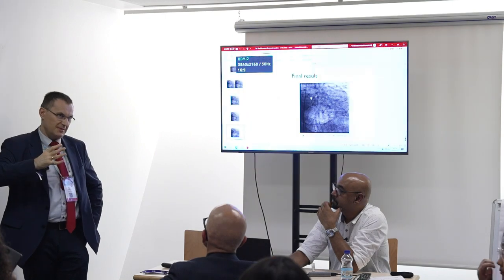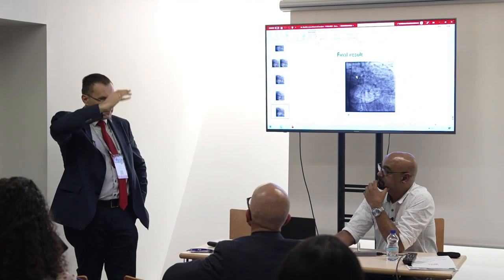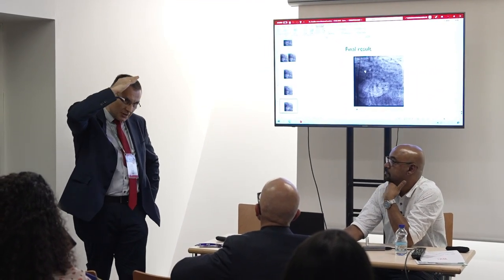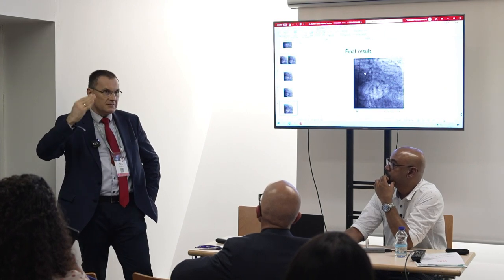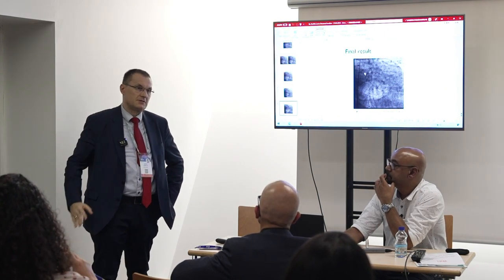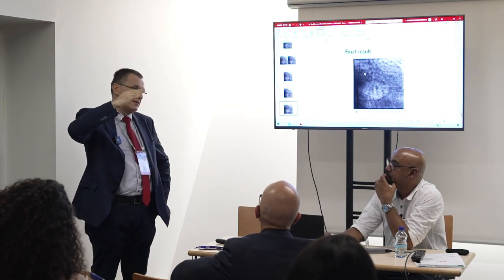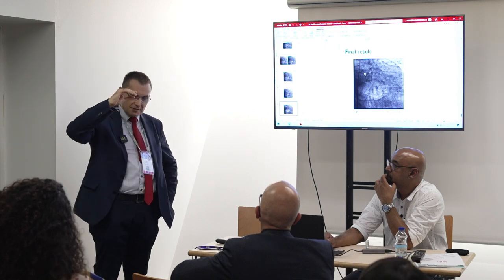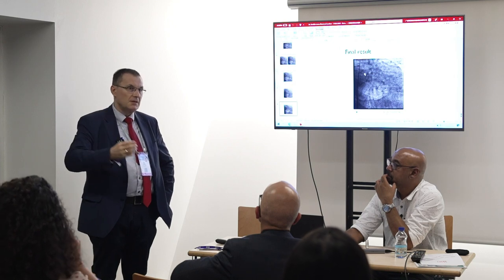As I told you, I placed an extra support wire intentionally. It is not usually recommended, but I did it to make a wire bias just to cut these edges of the plaque. But even that did not help. Actually, I think that the burr just made this cut, but distally there was some ring of calcium and it was just too far.